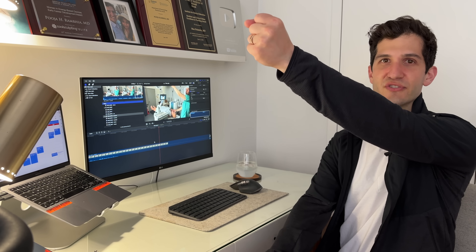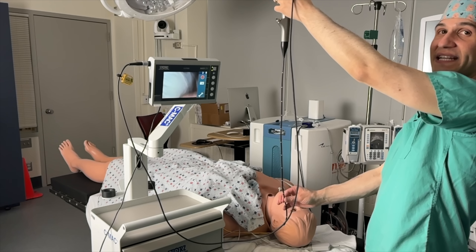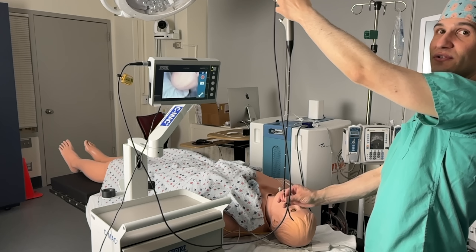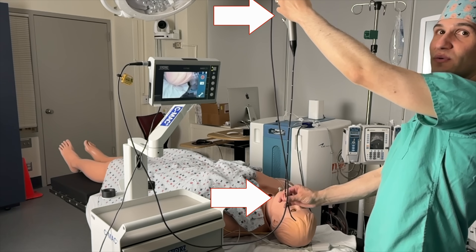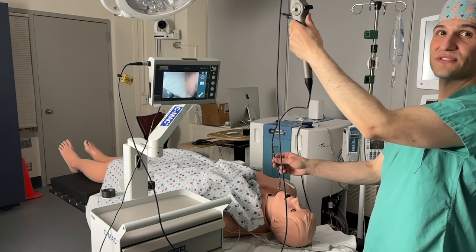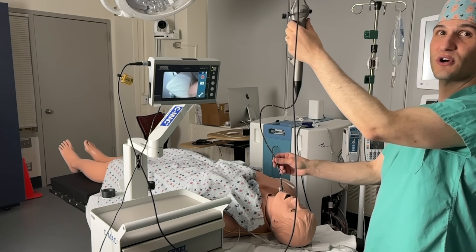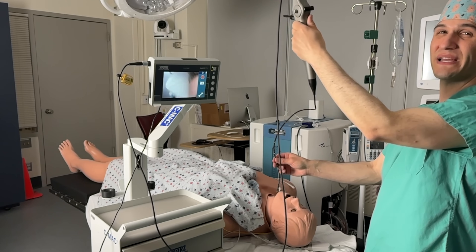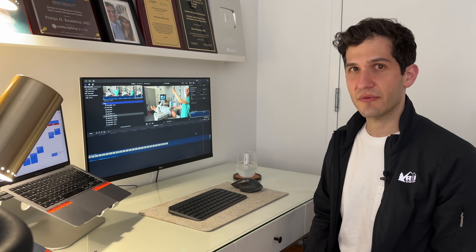The other point I wanted to convey — and it's actually kind of convenient that it's in slow motion — is that it's important to have tension on the scope itself. You do that by holding your arms out straight. If you have tension, then it's very easy to translate rotational motion from your top hand to your bottom hand. Whereas if your hands are bunched up and you try to rotate with your top hand, that rotation really doesn't get translated down to the bottom of the scope, making it a lot harder to navigate going clockwise and counterclockwise.